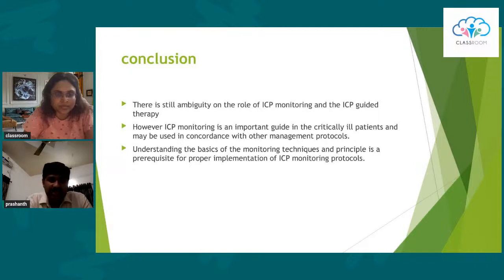Yeah, maybe. Actually, the conventional thinking is that looking at any arbitrary value of ICP to decide on treatment plans is useless, because most of this cerebral damage is known to occur at pressures below the threshold. However, there's another concept of compartmentalization of ICP. That is, if there's an injury to one side of the brain, the pressure on both sides may not be equal, and there may be gradients between the two compartments. So in this scenario, ICP monitoring is very essential even after a decompressive craniectomy.